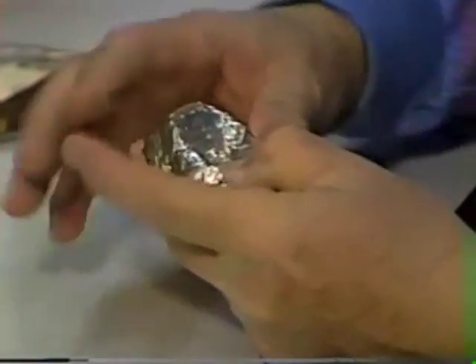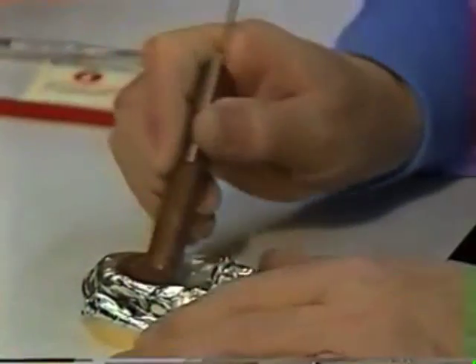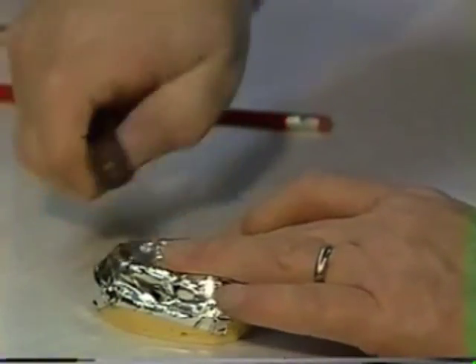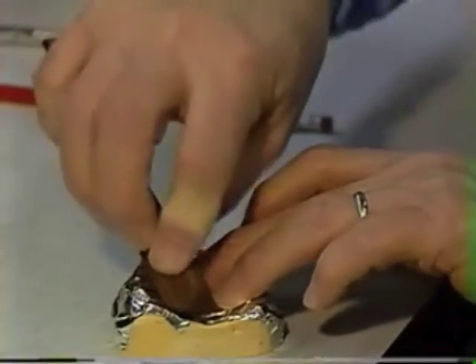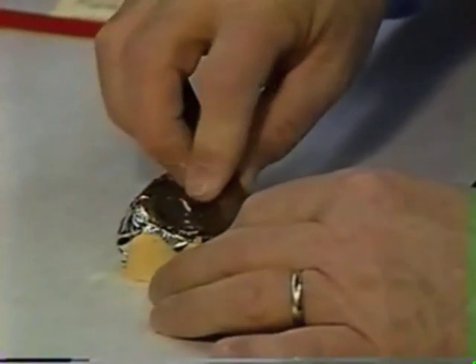And once you've done that, and you've got it burnished in with your fingers like that, what I usually like to do is take a wooden handle of a knife, and that will burnish it quite well. And you can work a lot of the wrinkles out of it just by burnishing the tin foil to get it down to as smooth as we can get it type of surface.